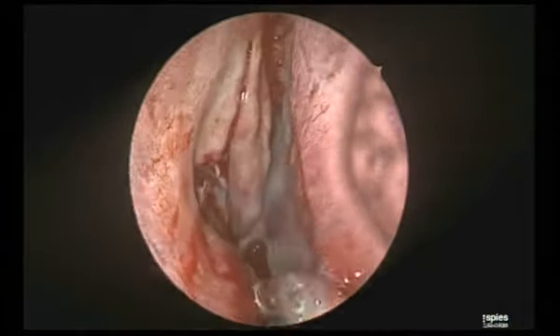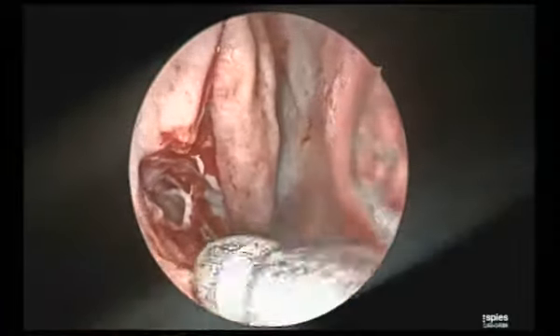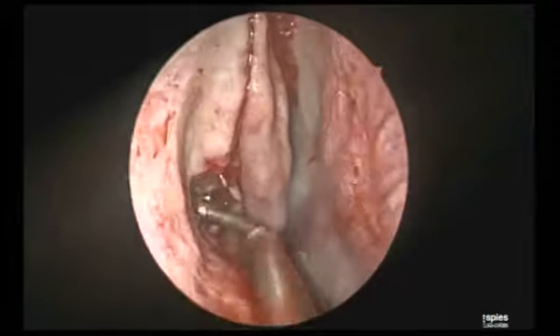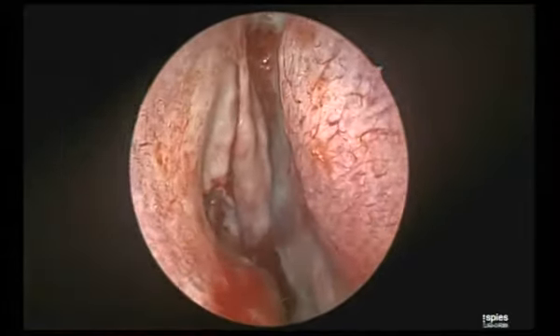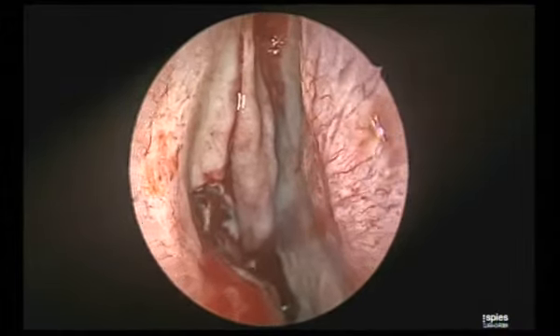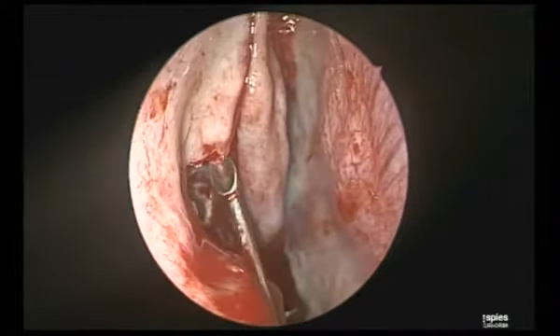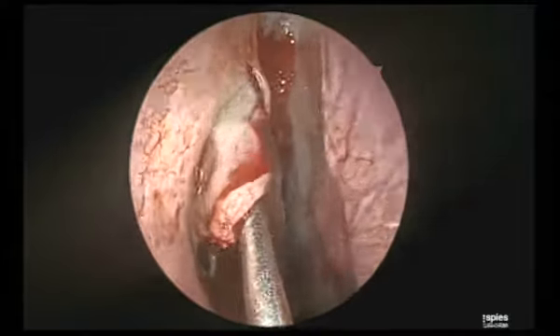For this benign situation, I can't afford a chance of giving a possibility of a cardiovascular insult. Remember that case close to Thane, Ashish, after the infiltration? Satish, when you do a septoplasty, you infiltrate xylocaine or only saline? Just only saline, for hydrodissection. Now, no, under local.